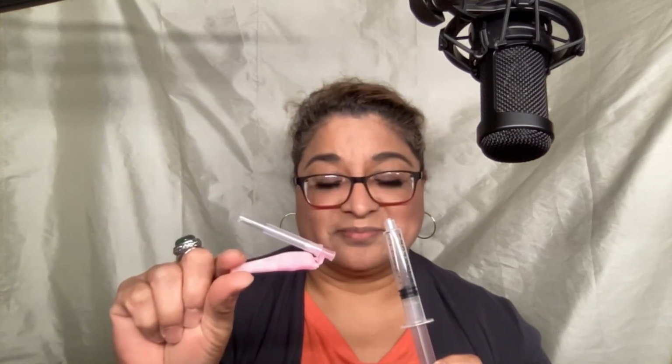Then the blood is immediately collected in this clear plastic 10 cc syringe. The black markings on the plastic indicate the dosing measurements in milliliters. The plunger is pulled back so that the blood fills inside of the syringe, and then the physician hands off the syringe to the nurse along with this 18-gauge hypodermic needle. The 18-gauge needle is identified by its pink-colored sheath to protect you from an exposed needle.